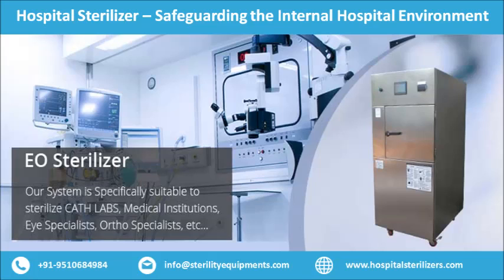The sterilization cycle is a four-phase process, namely conditioning, sterilizing, exhaust, and air purge. In the conditioning phase, a vacuum pump removes air from the chamber and allows the controlled release of moisture or steam through the chamber heating system, raising the relative humidity. An ETO diluent mixture is inserted into the chamber after the process of humidification, triggering the exposure phase.